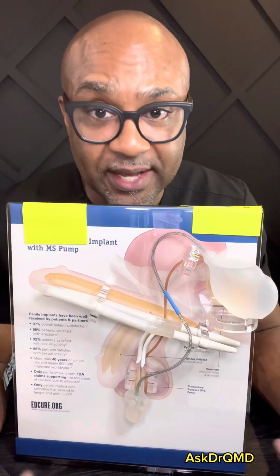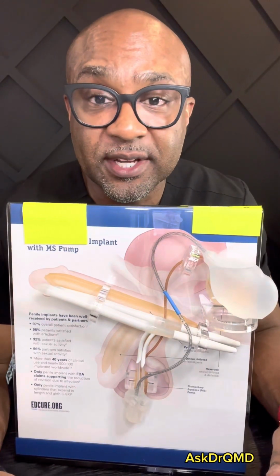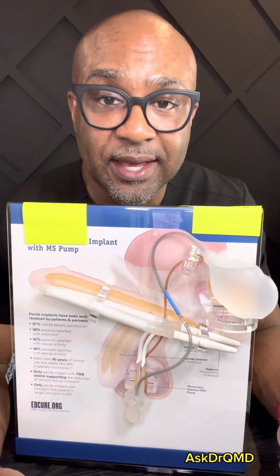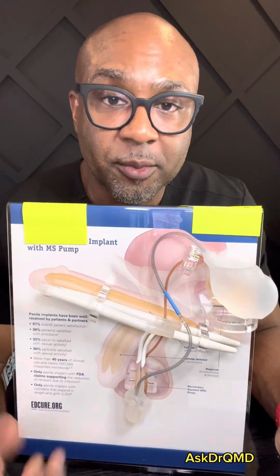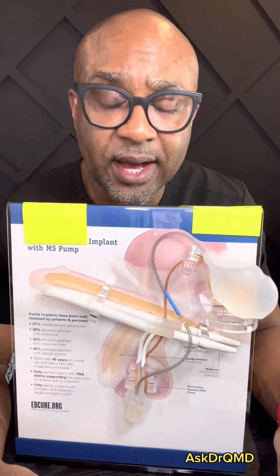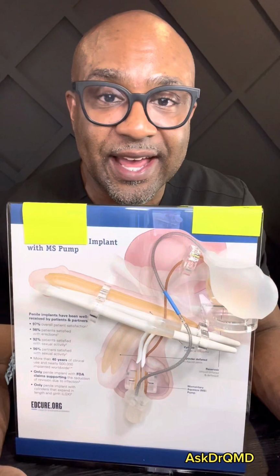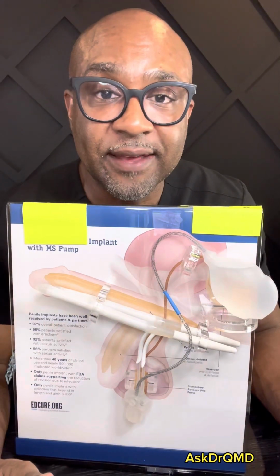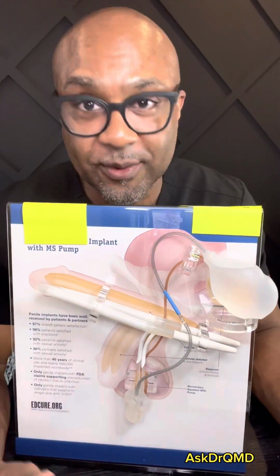And because it's a foreign body, it can become infected, particularly if you're diabetic. So if you do have diabetes and you need a prosthetic, you generally want to have your hemoglobin A1C below 7 before proceeding with this, because you are at higher risk for infection. So that's a 3-piece penile prosthesis in a nutshell. It has the highest patient and partner satisfaction rating. And if you are in the category where all else has failed, this is a great option.